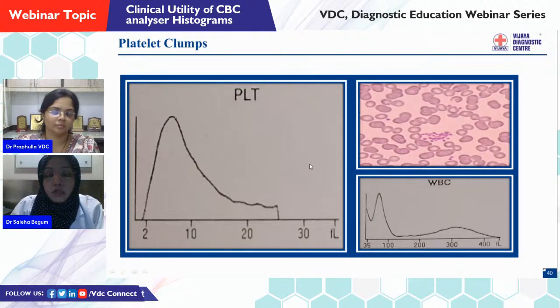But another clue to platelet clumps you can see in the WBC chamber, where the lymphocyte peak is not starting at the baseline. Instead, it is starting somewhere in the middle, as you can see here. One cause I discussed earlier for such a peak is an NRBC. Now here in this case, it is a platelet clump, which is very much logical. So we have to interpret these graphs in relation to other cell populations also, not only a single cell, like in this case.